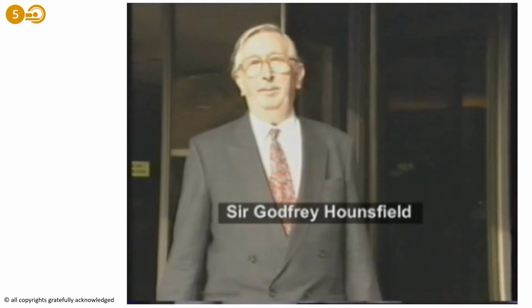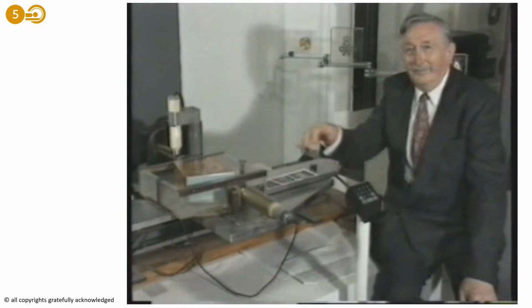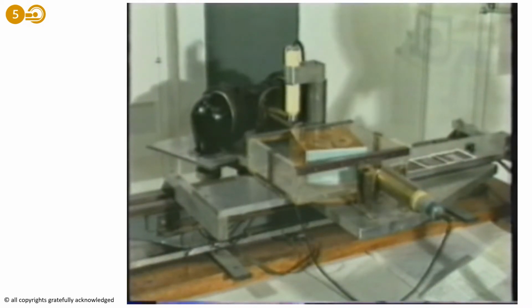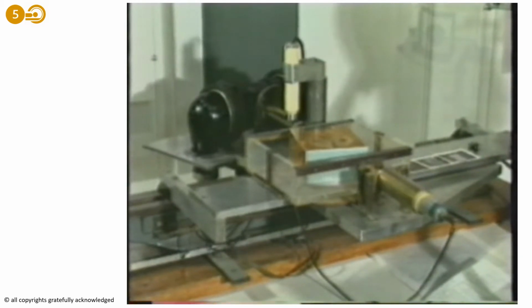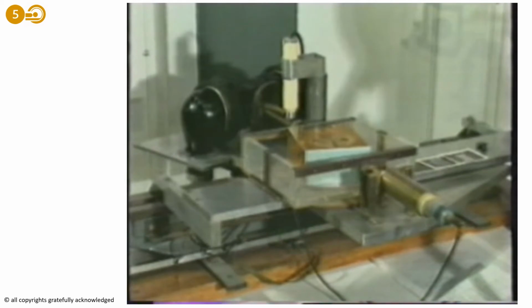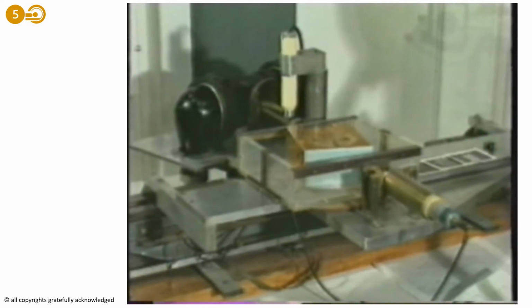It's been requested that I show you some of the early pieces of equipment that I used for testing the principles of the scanner in the early days. As it happened, an old lathe bed was available in the lab, and by using odd equipment also found around, I was able to build this lab test machine, which would demonstrate the principle of the system.